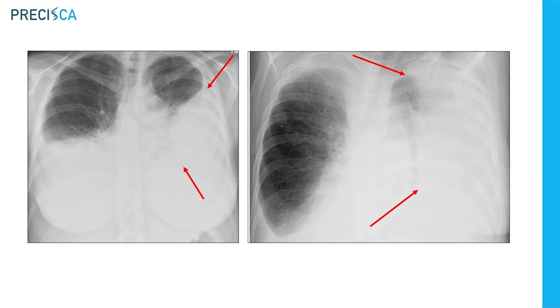And I'd like to share with you images of X-rays so you could see what it looks like, and CT scans as well. This is an image of a frontal X-ray on a patient. And what we see is the dark area is the lung. This is the lung tissue. But the white area is the fluid. And as I mentioned, it's denser. So it's sinking to the bottom and the lung is pushed up.